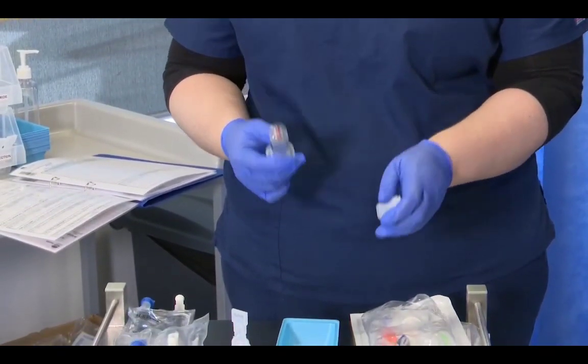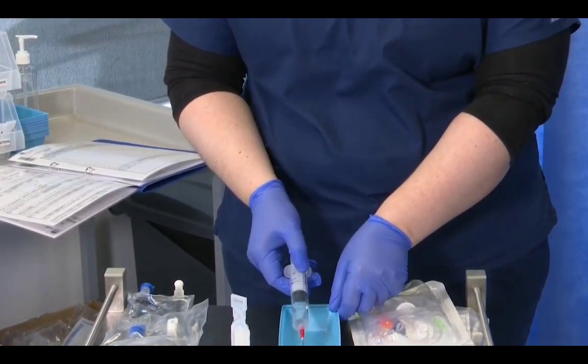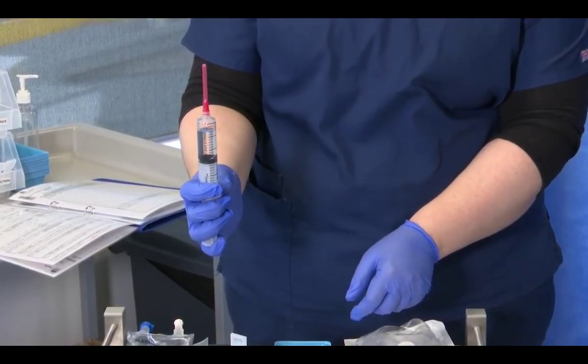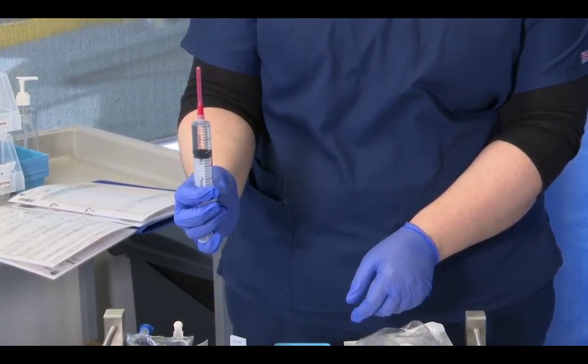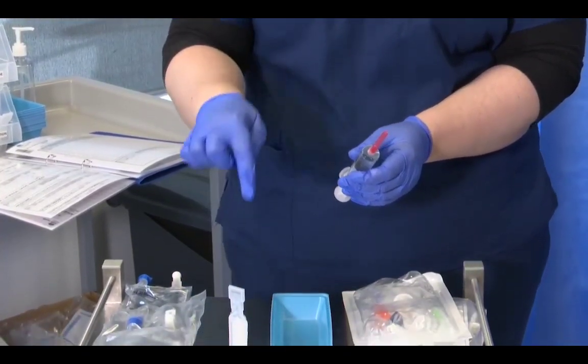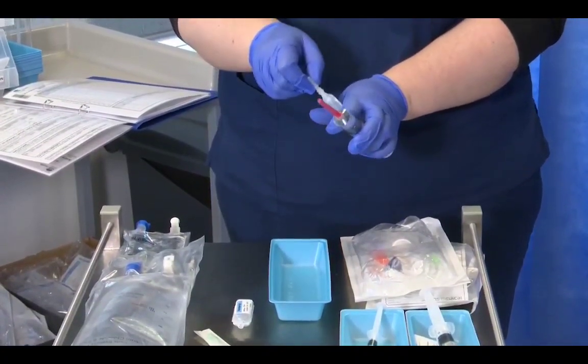It's empty. So once we've done that, we recap our needle, remove the air, and get ready for our second ampule. Again, we must keep this ampule until the bedside check.